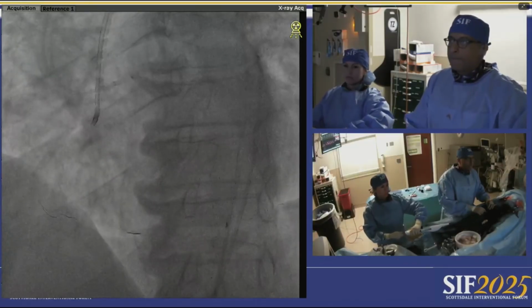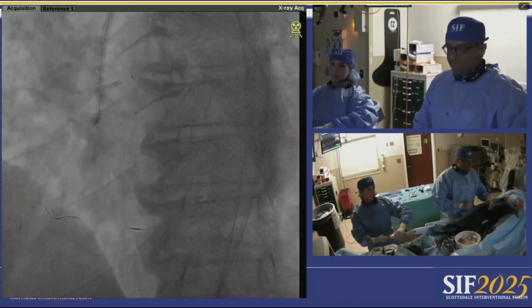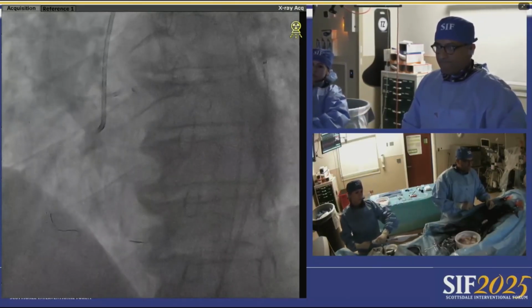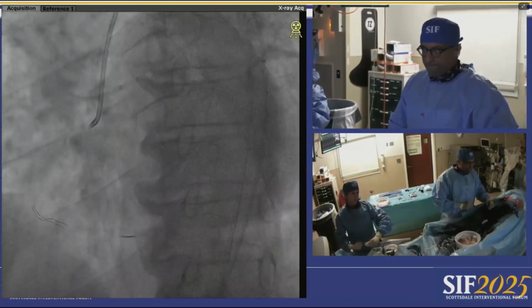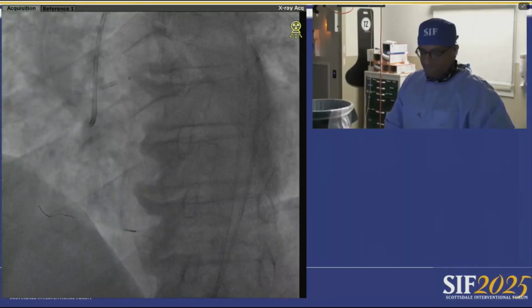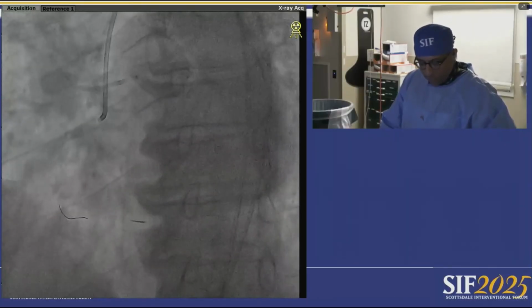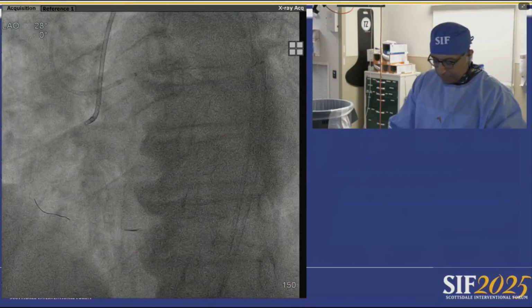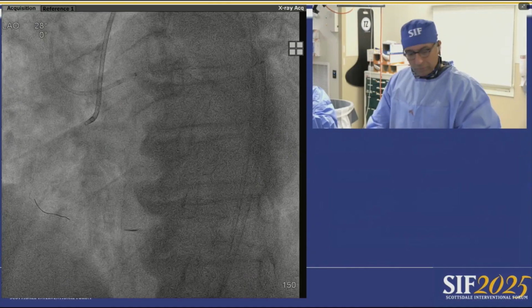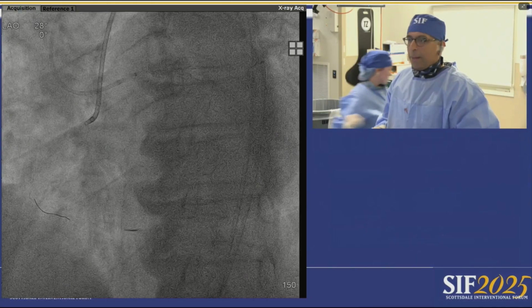The case was divided out nicely here where the left main was taken on at a separate setting. The indications for Impella placement with normal EF are very scarce. In my practice, sometimes that becomes frustrating because implementing an Impella up front with a normal EF like this patient, and something goes wrong in terms of complication of access, how do you justify that and how do you defend yourself?